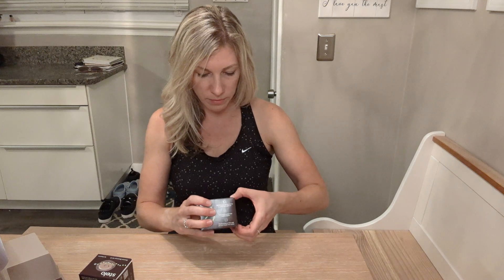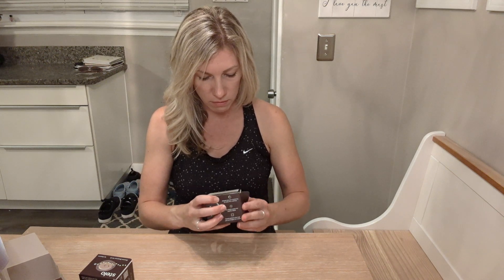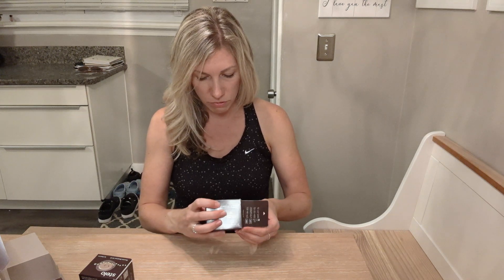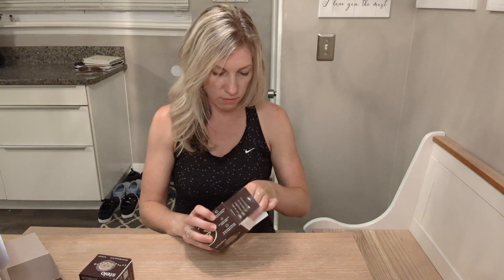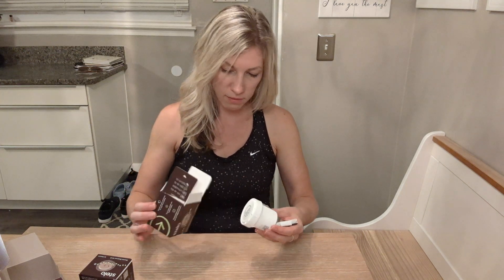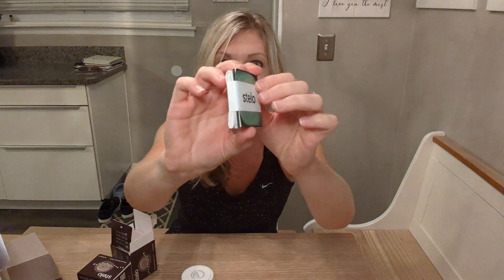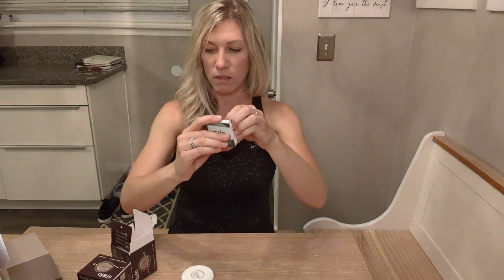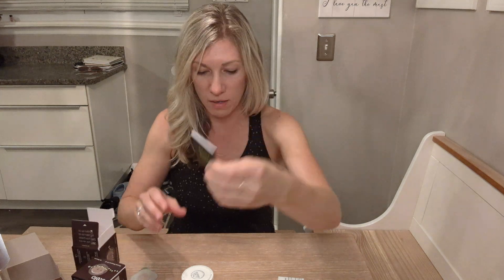It says waterproof up to eight feet, so you can't go more than eight feet deep, and it tracks glucose 24/7. The app works on Apple, Android, and any other smart device. So we've got this container here — a little rubbery on top that looks like we'll need to twist off — and here we go with our directions.